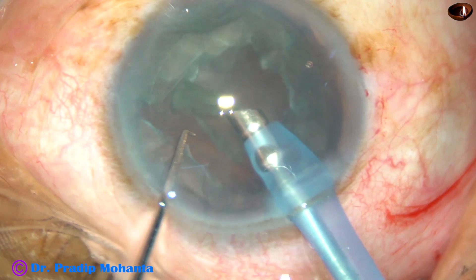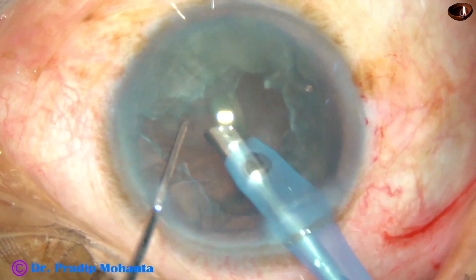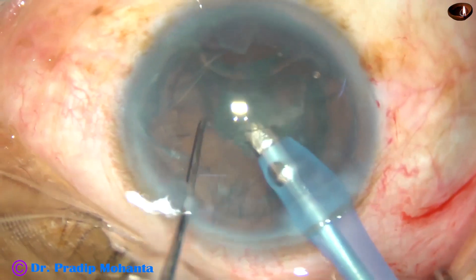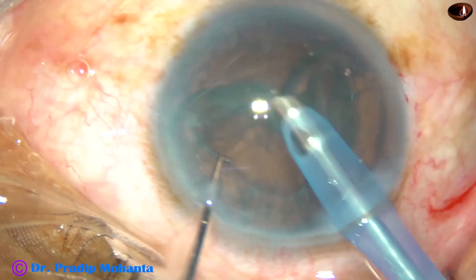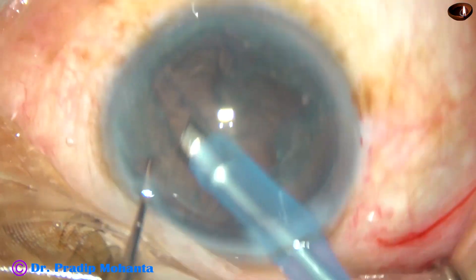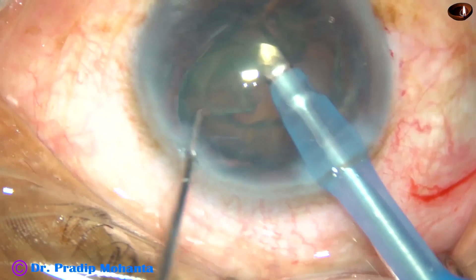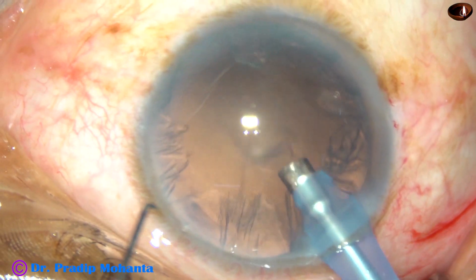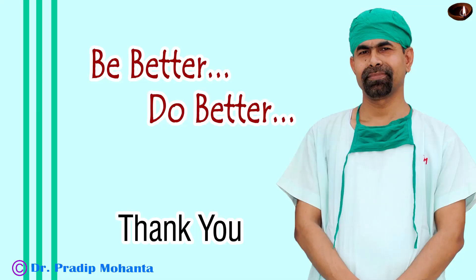So this is a nice technique for soft cataracts, but in all cases we cannot do carouseling. Most of the cases, we can do the mechanical job and lens tilt technique — lens tilt technique particularly when the rexis is large. Thank you very much for your attention. Hope these strategies will help you in managing your soft cataracts.